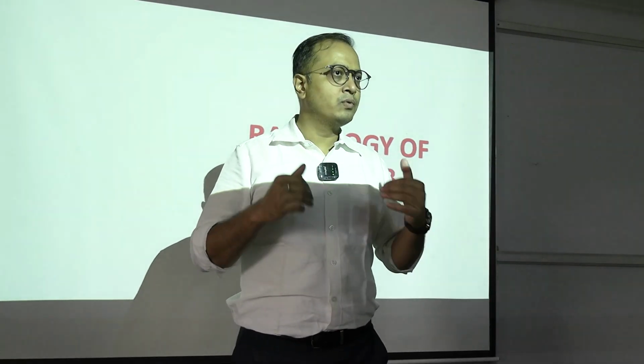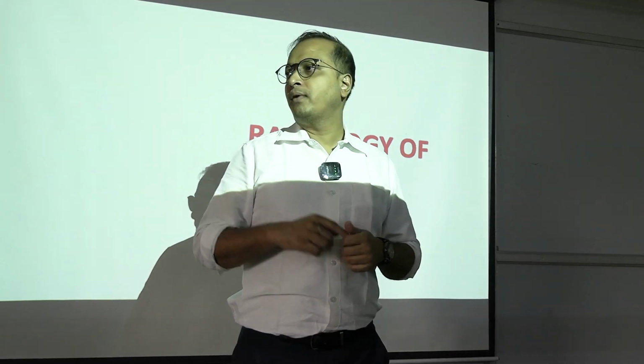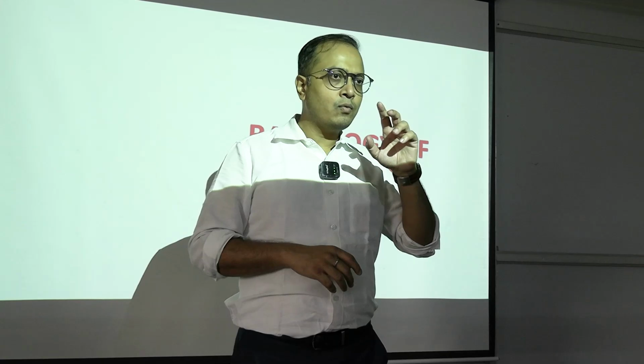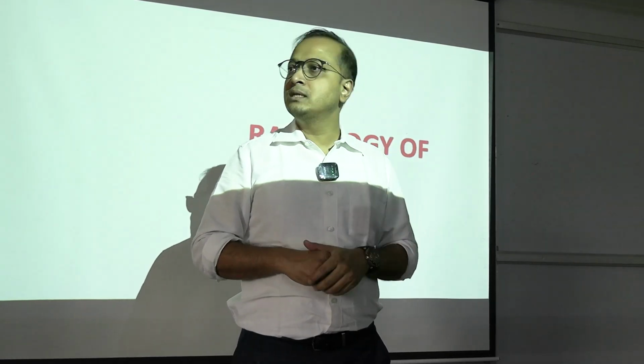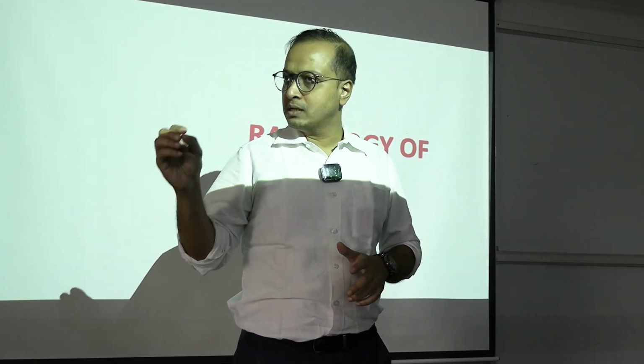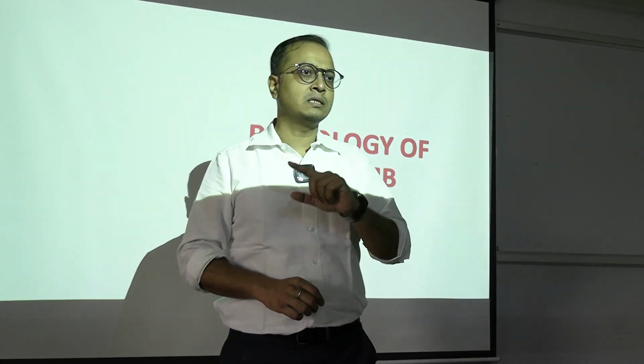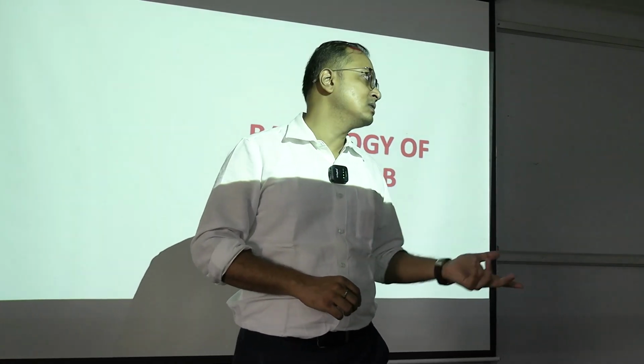Now, once these views come to us, we have to identify the sides of it. That means which is the right side and which is the left side. In a film, unless it is written on it, whether it is right side or left side, we are not going to make any comment, even though we understand this is right or this is left.